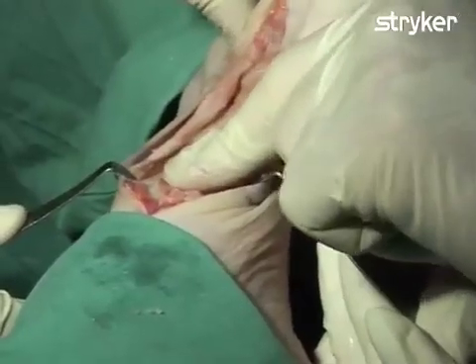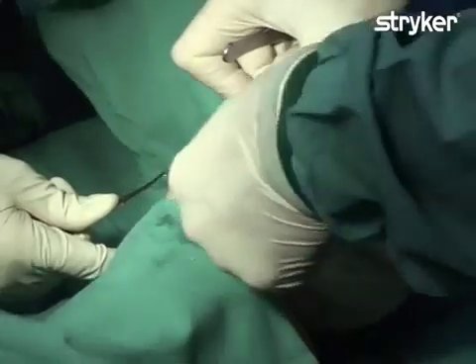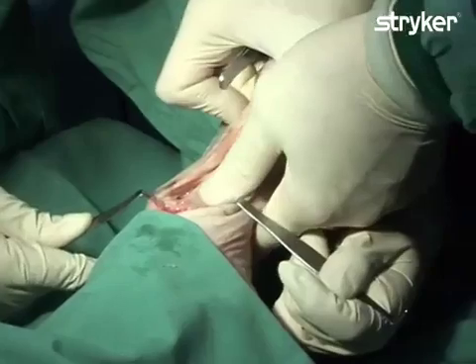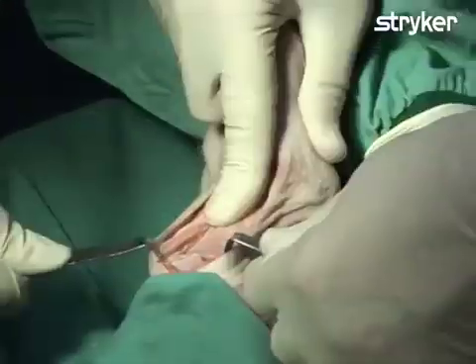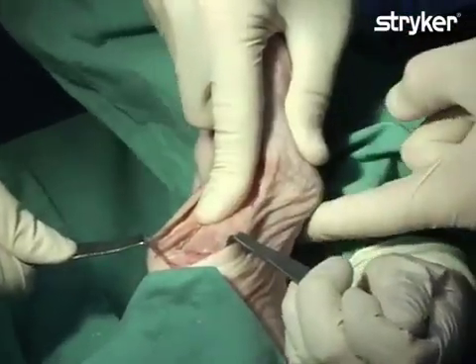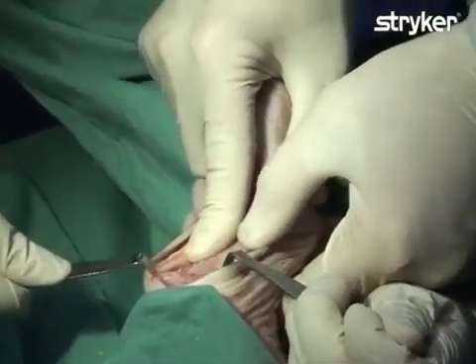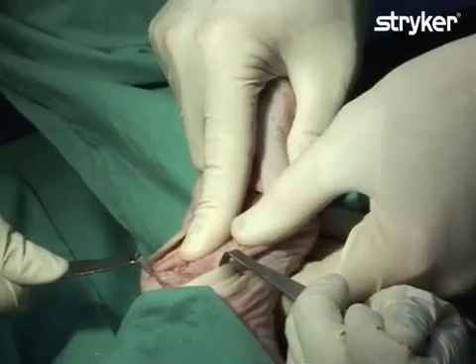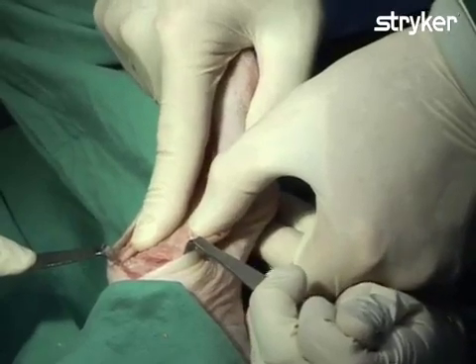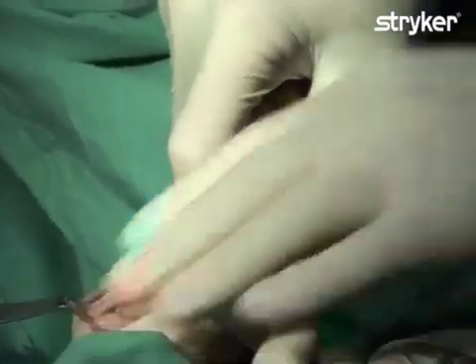The first metatarsal phalangeal joint can now be put into varus and the osteotomy can be temporarily reduced, illustrating the desired final position of the first ray. Since the first ray was shortened through the removal of the articular surfaces, the shortening must be compensated by displacing the metatarsal plantarly, or downward. You can see the initial neutral position and the position of the metatarsal after being displaced plantarly to compensate for shortening of the first ray.